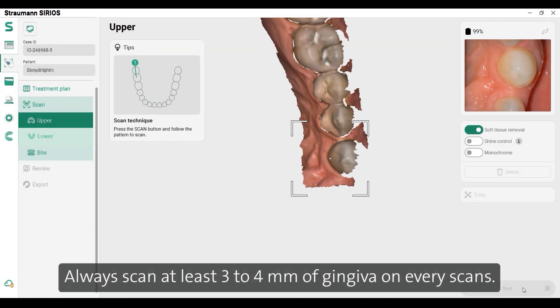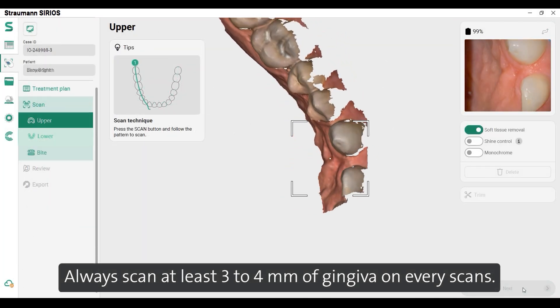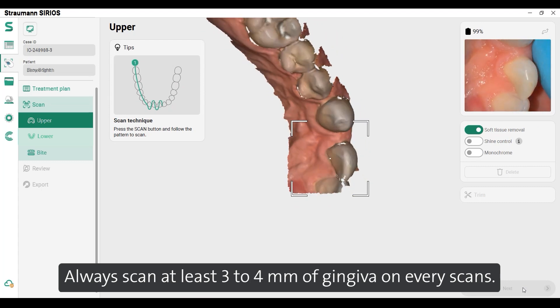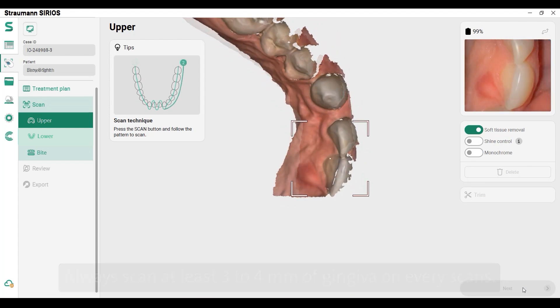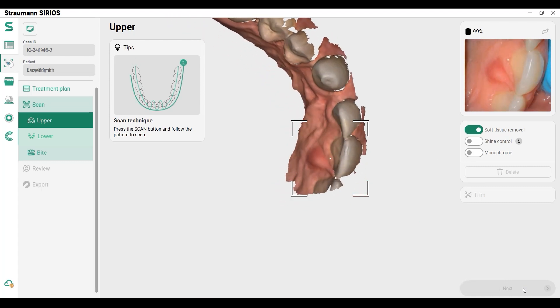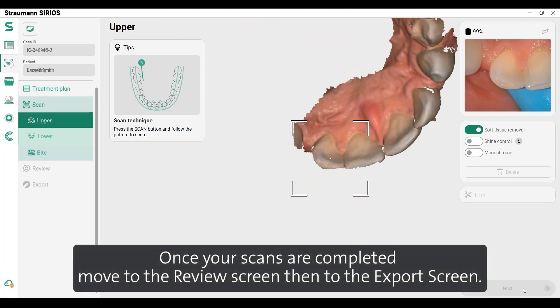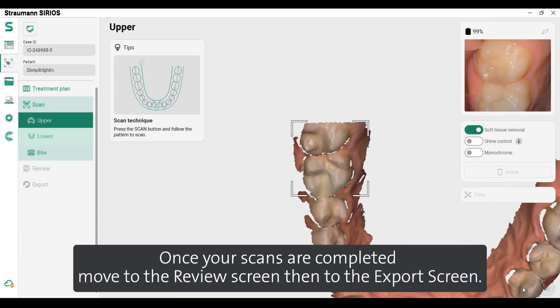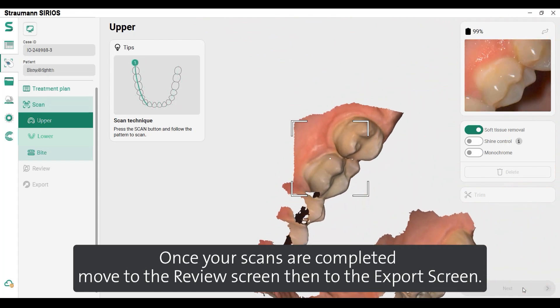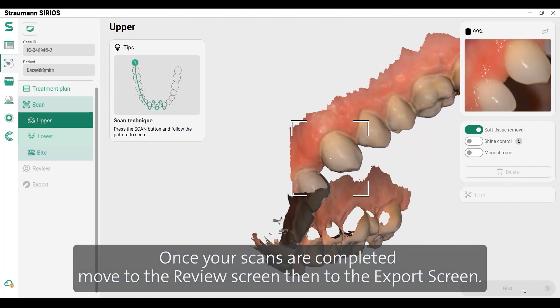Always scan at least 3-4mm of gingiva on every scan. Once your scans are completed, move to the Review screen, then to the Export screen.